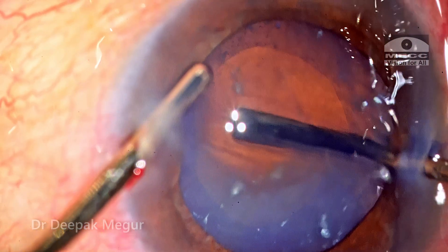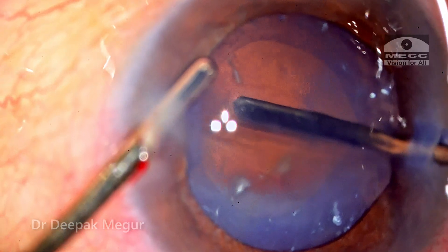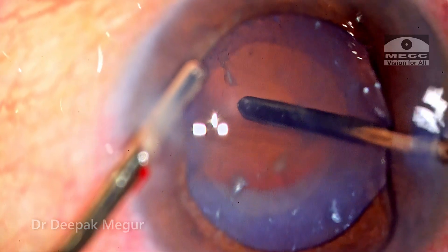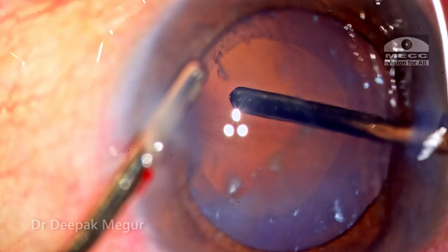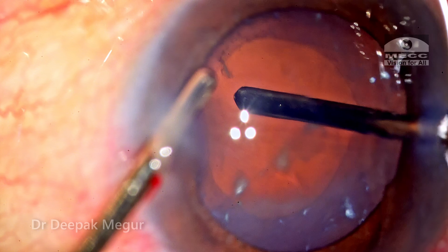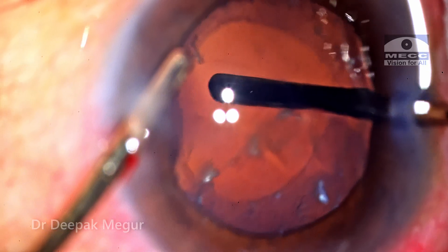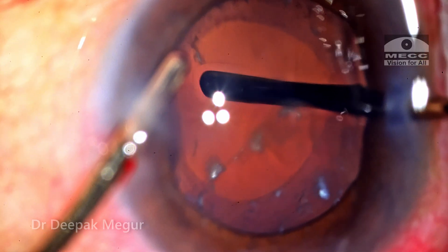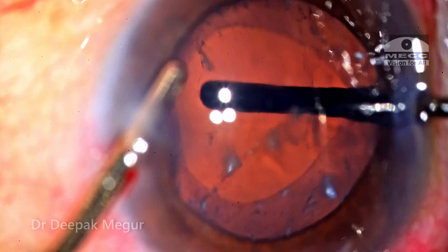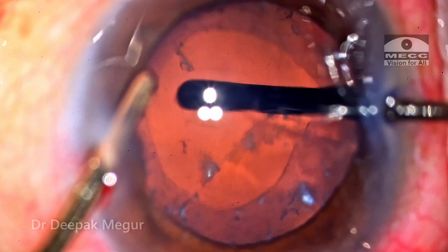The goal is to keep the opening small, circular, and central. At this point, the size of the posterior capsule rhexis is very well visualized as the red glow is significantly better. The vitrector goes through the posterior capsule opening and is placed slightly at a lower level under the posterior capsule, with its bevel facing down, and limited anterior vitrectomy is being performed. Note that as soon as the vitrectomy is begun, the settings are reverted back to the classical irrigation, cut, and aspiration mode. The IA cut mode was used only to engage the capsule and perform the posterior capsule rhexis.